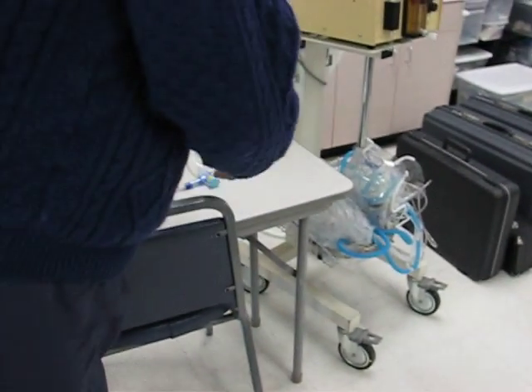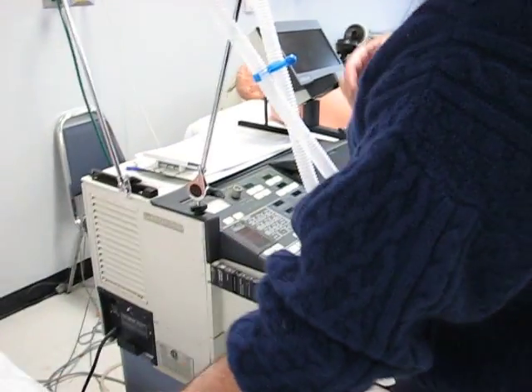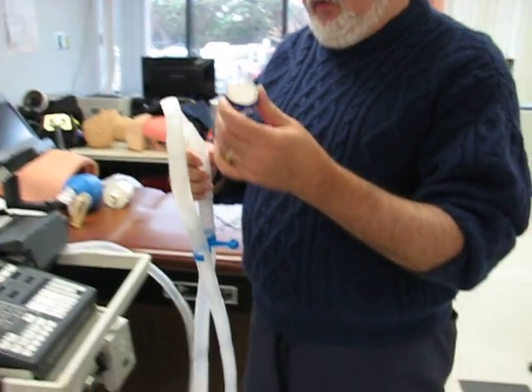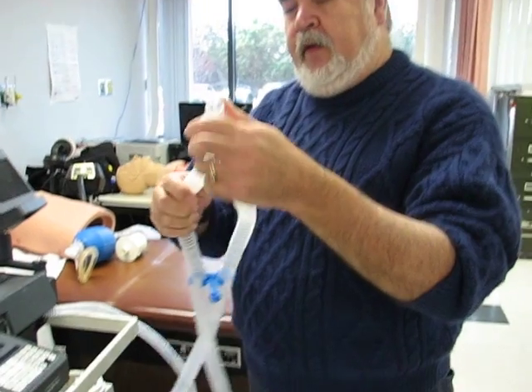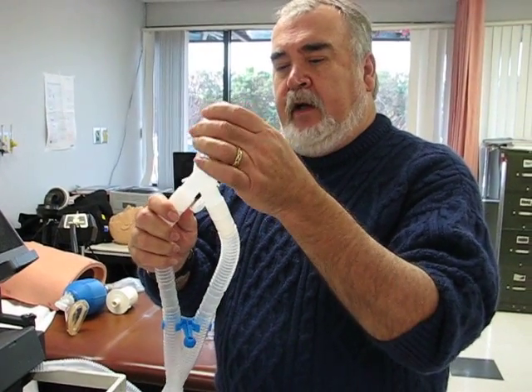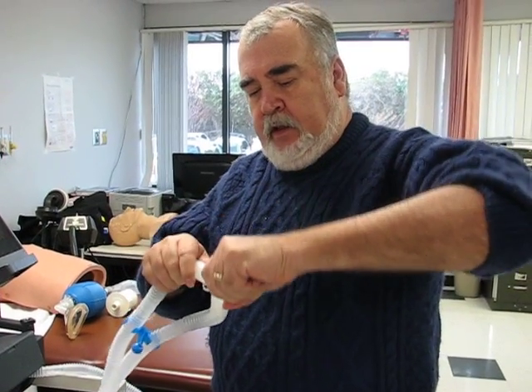Here's the heat-moisture exchanger that we use if we don't have an actual heated humidifier. That will go on the Y of the circuit, and again, it only fits the right way — you put it in like that.